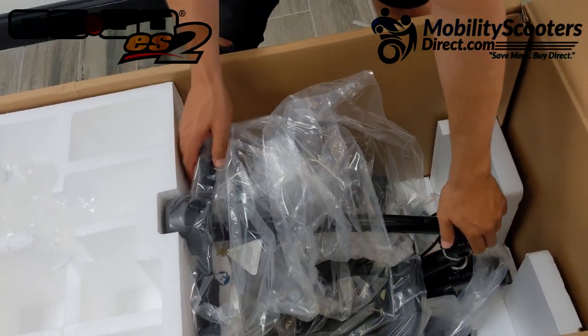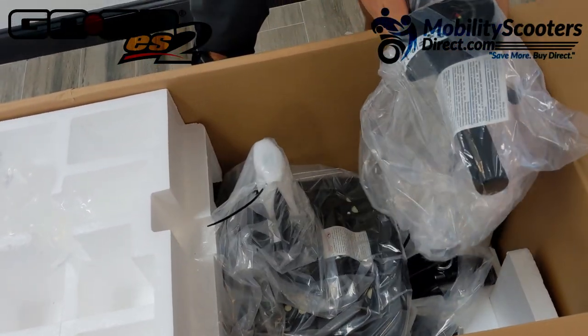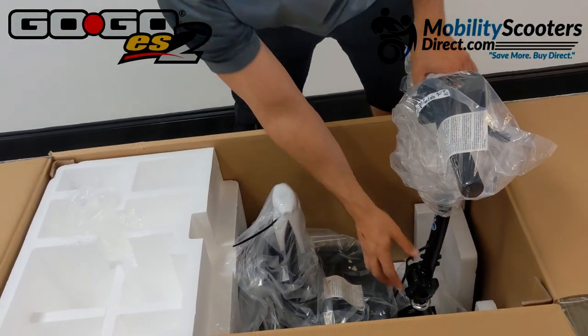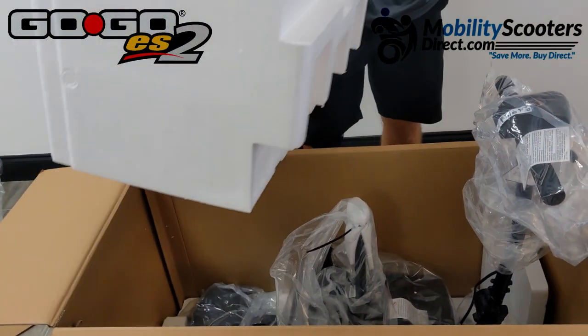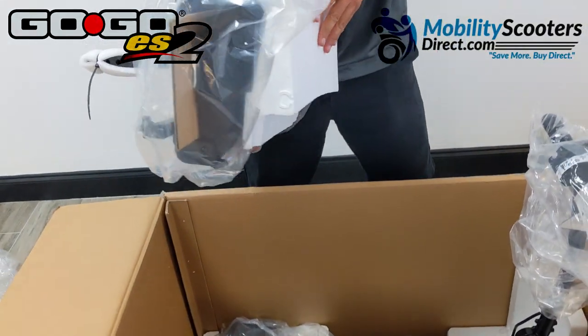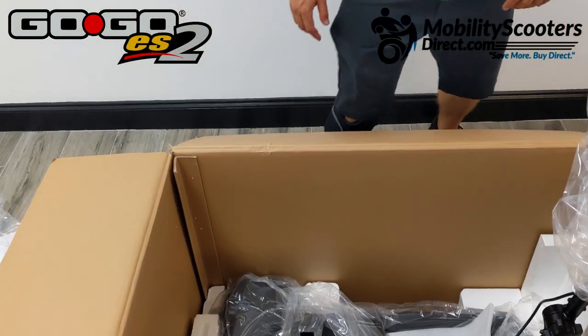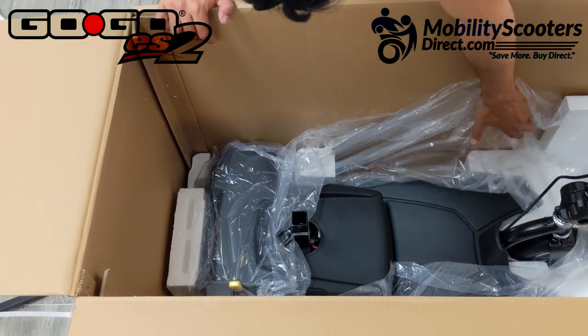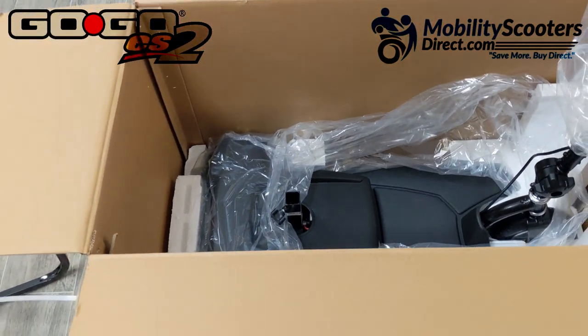The next thing you want to do is loosen the tiller adjustment knob. That knob allows you to adjust the tilt of the handlebar — you can bring it closer to you, away from you, or fold it down. Once you lift it, you can remove that other styrofoam block and then remove the seat. The seat comes packaged, so just go ahead and unpackage it, put it to the side, and begin to unpackage the scooter.